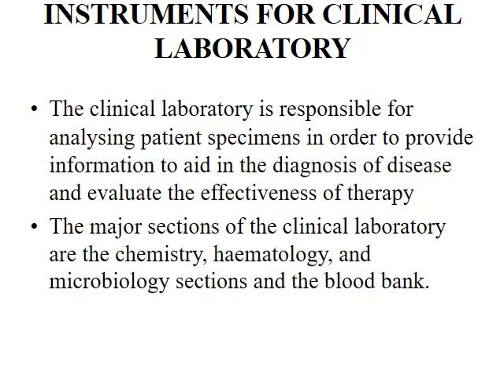The clinical laboratory is responsible for analyzing patient specimens in order to provide information to aid in the diagnosis of disease and evaluate the effectiveness of therapy. The major sections of the clinical laboratory are chemistry, hematology and microbiology sections and the blood bank.